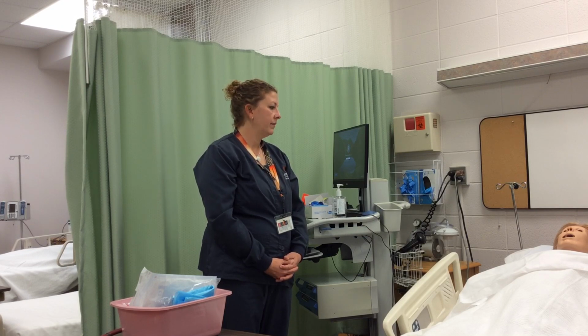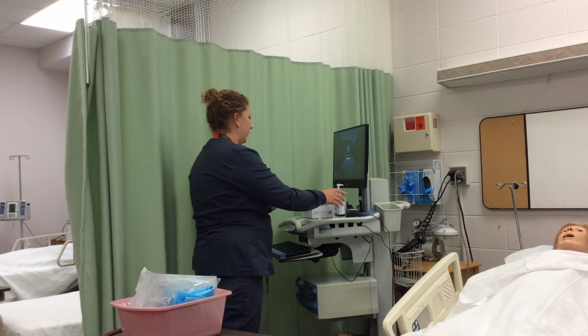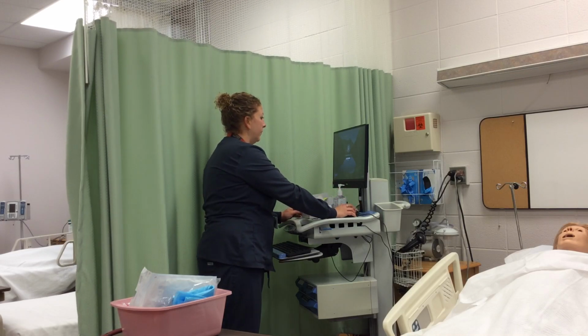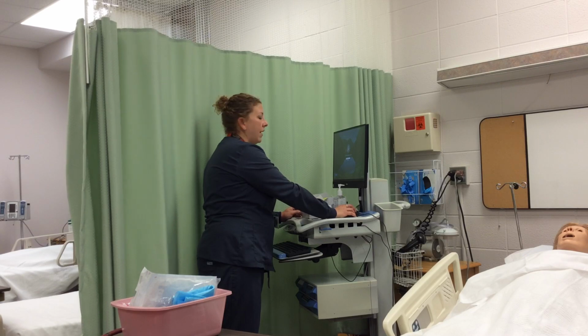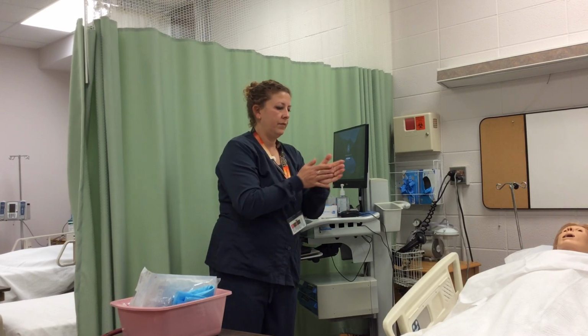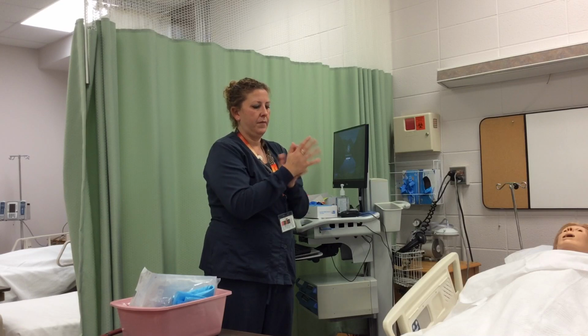Start by verifying the healthcare provider's orders for the type of NG tube to be placed and whether the tube is to be attached to suction or a drainage bag. I verified the healthcare provider's orders. Perform hand hygiene and gather the necessary equipment and supplies.